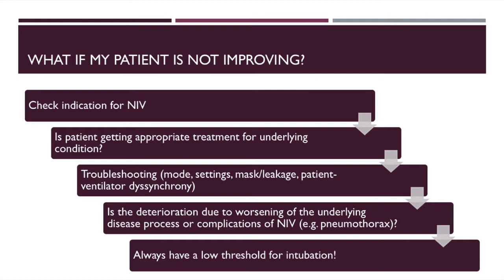Ensure that mask fit is adequate and there is no excessive leak, and that there is no significant patient-ventilator dyssynchrony. Sometimes, the deterioration could be due to a worsening of the underlying disease process or as a complication of the NIV. Regardless, always have a low threshold for intubation if your patient is not improving.